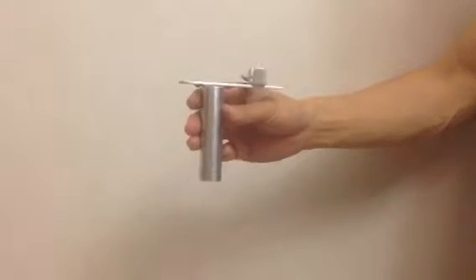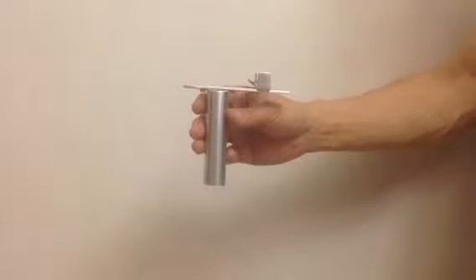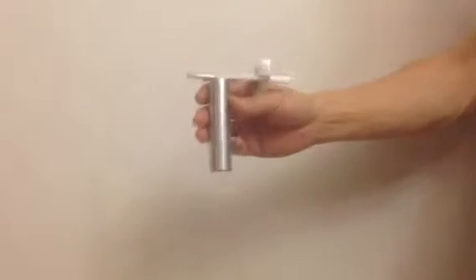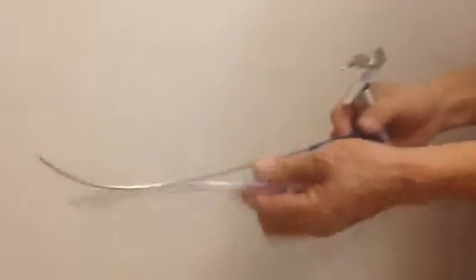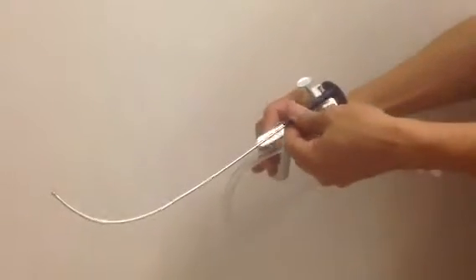This is the intubation device called the intubation stylet holder. This is the stylet holder. What you do is you put the stylet into it.